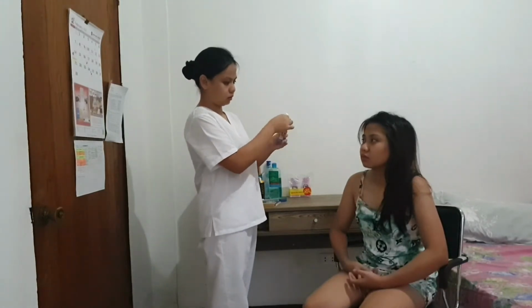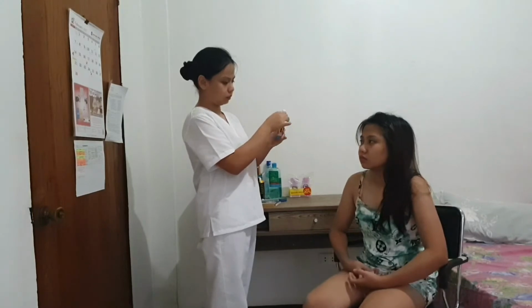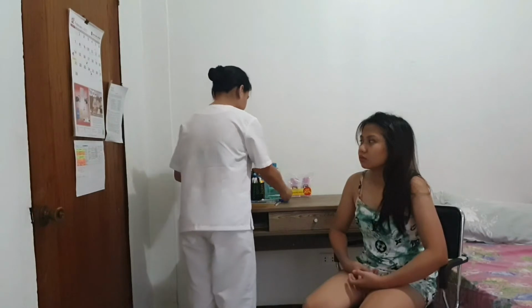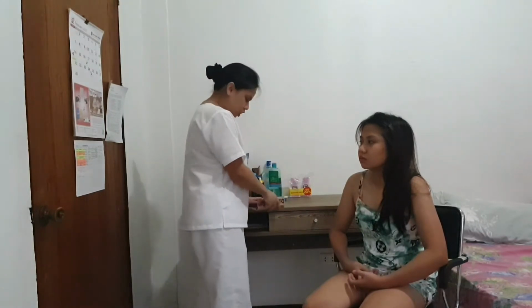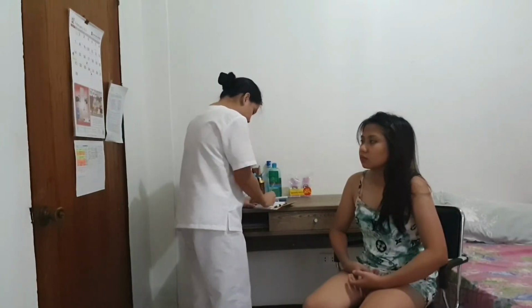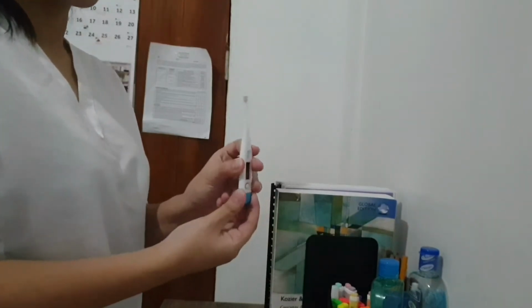Okay. So now we're going to do it from the stem to the bulb because of course, the stem now is much cleaner than the bulb because the bulb is the one that is close in contact with the patient's underarm. Okay. I'm now putting it on my worksheet. 35.5 degrees Celsius.